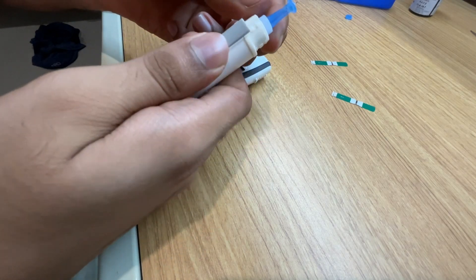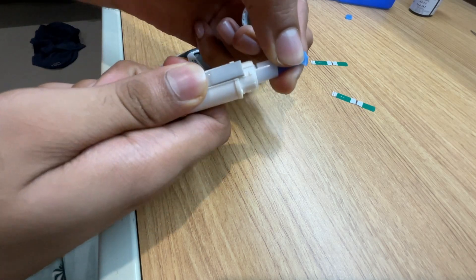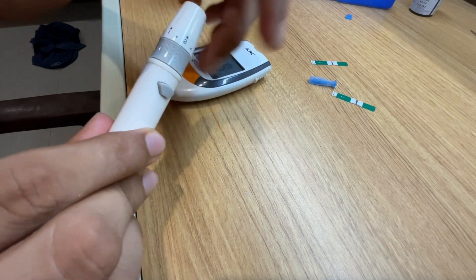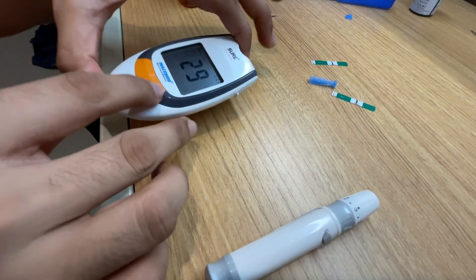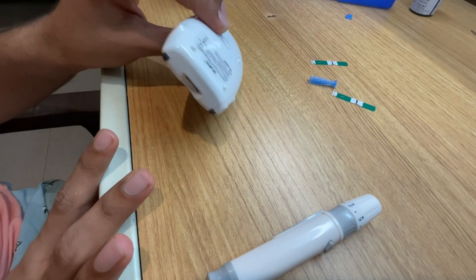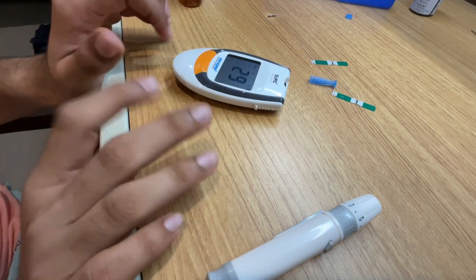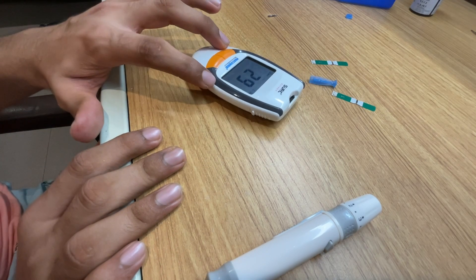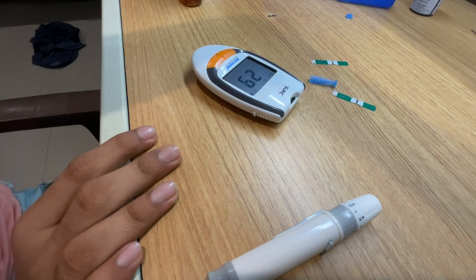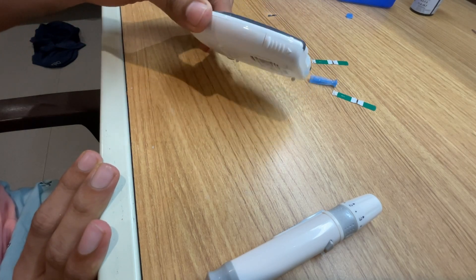Important things to keep in mind: do not use this device above 40 degrees Celsius. The reading range is from 20 to 600 mg/dL. The device uses a 3V battery and that battery can last up to 1000 tests, which is pretty cool.